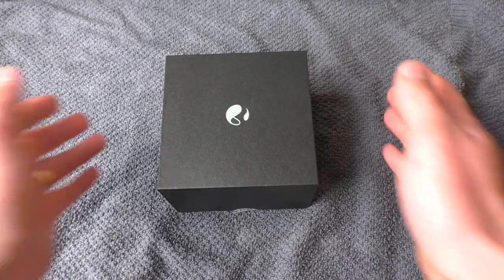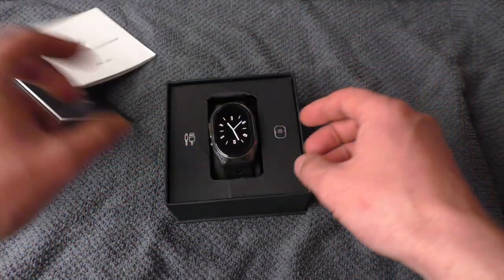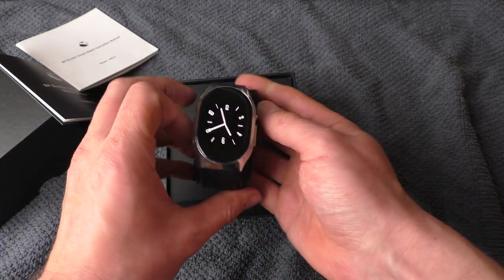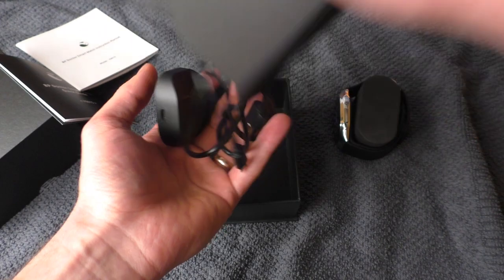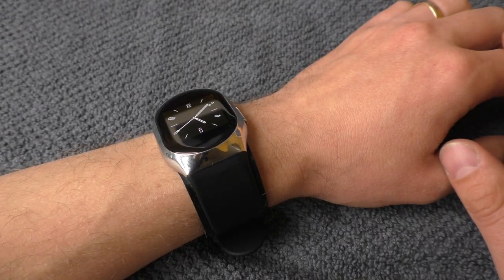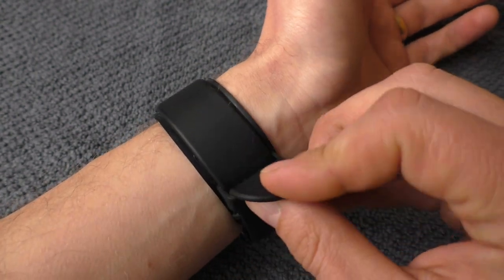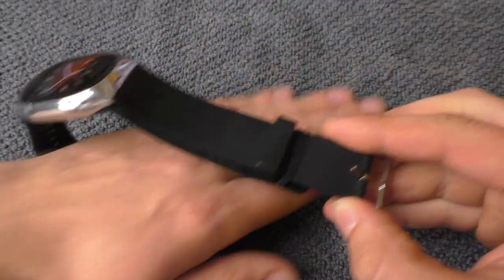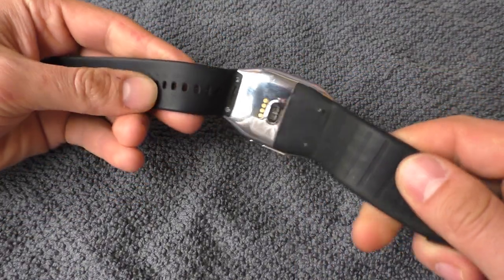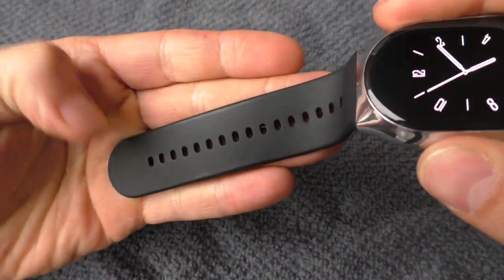Now let's take a better look at the watch. It arrives in a box where you will find a user guide, instruction manual, the watch itself, and a USB charger. Comfort is very good — it is very stable on the wrist and the strap feels very nice. It's something in between silicone and rubber: not as sticky as silicone, yet not as stiff as rubber.